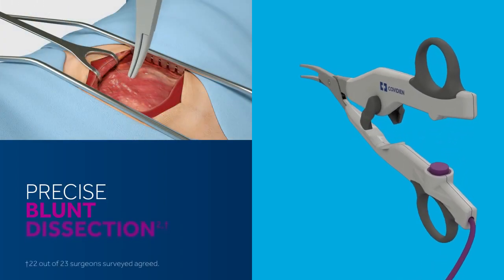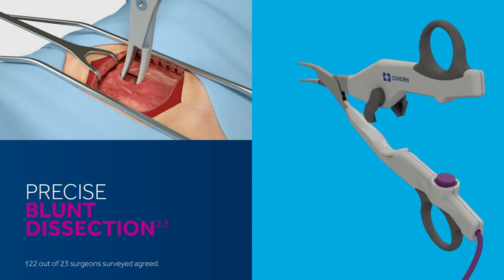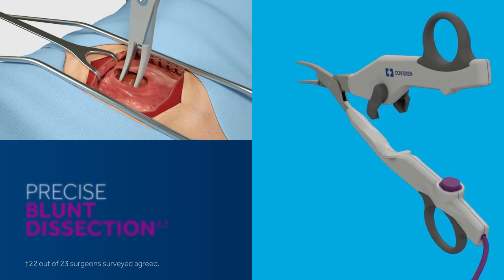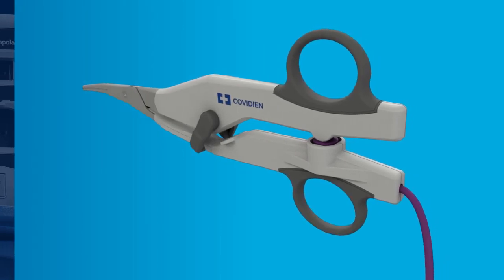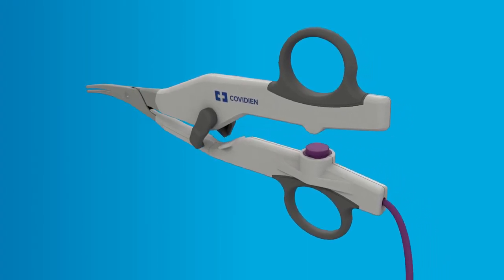Precise blunt dissection is achieved by the slim symmetric jaw design, and it is powered by the FT10 or LS10 energy platforms so it seamlessly integrates into your current workflow.